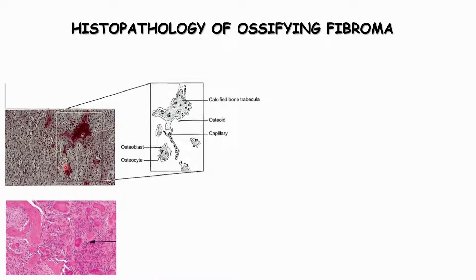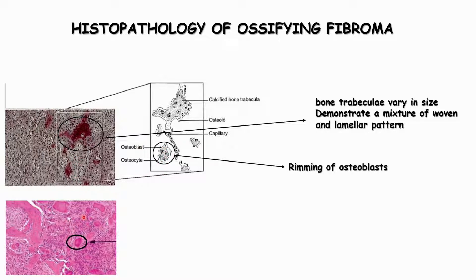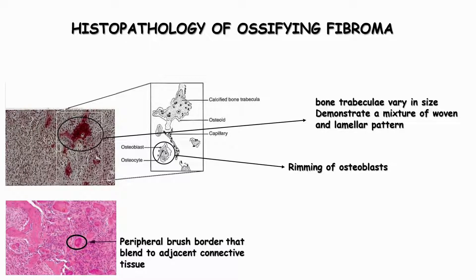The bony trabeculae varies in size and exhibits a woven and lamellar pattern, and also shows rimming of osteoblasts at its border. The cementum-like structure shows a peripheral brush border, meaning it blends into the adjacent connective tissue.